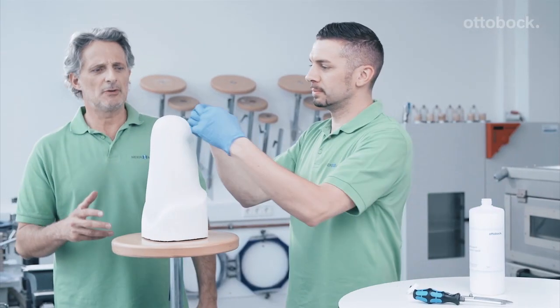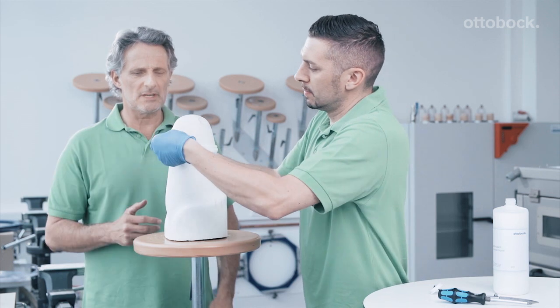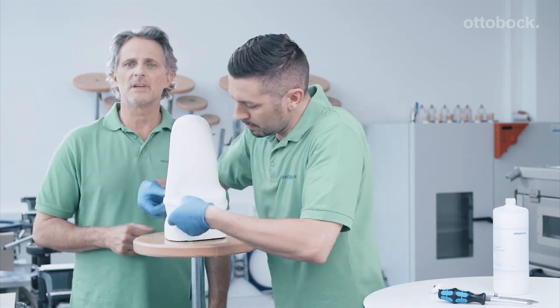In our example, 12 millimetre thickness of the sheet means about 12 minutes of oven time. We can take advantage of this by using the time to prepare the plaster model for the vacuum forming process. My colleague soaks a residual limb sock in plaster parting agent and then pulls it over the model. More plaster parting agent can be applied later if needed.